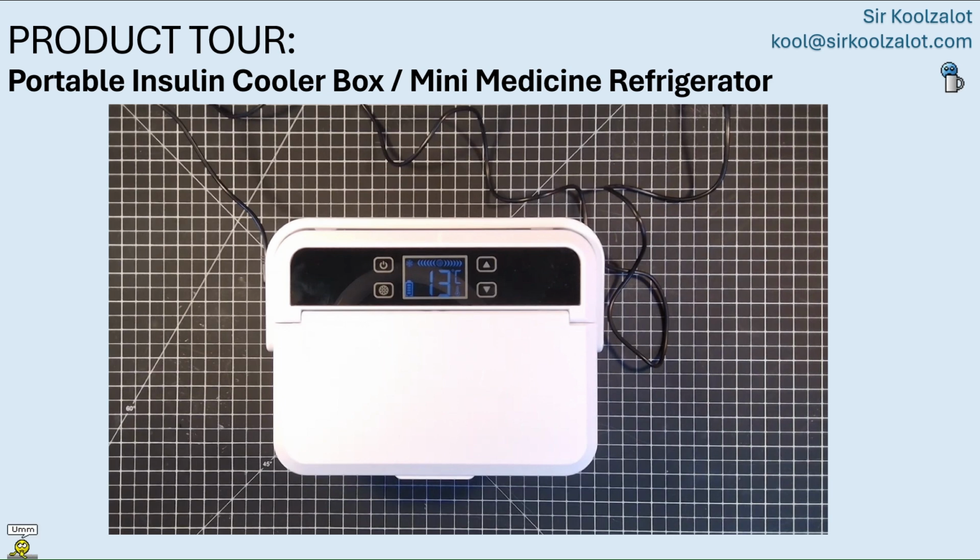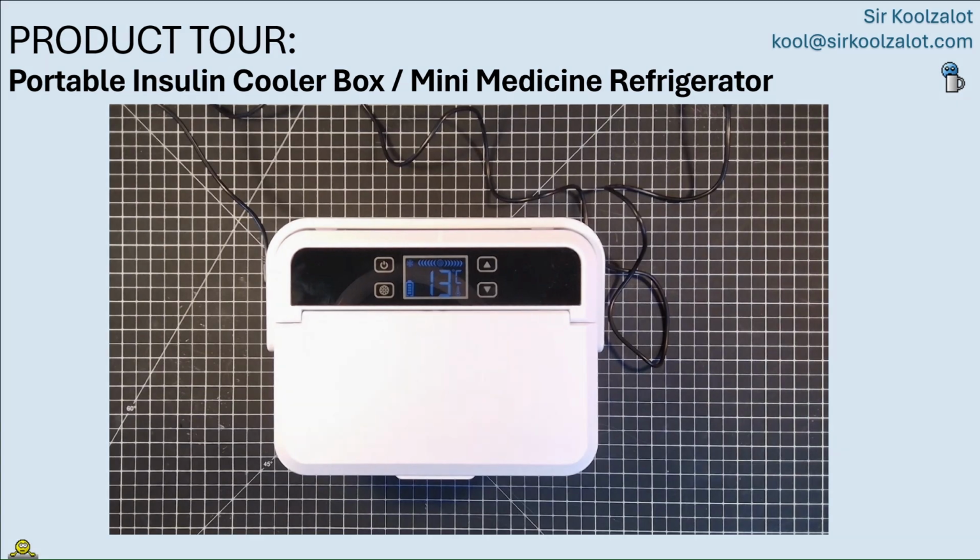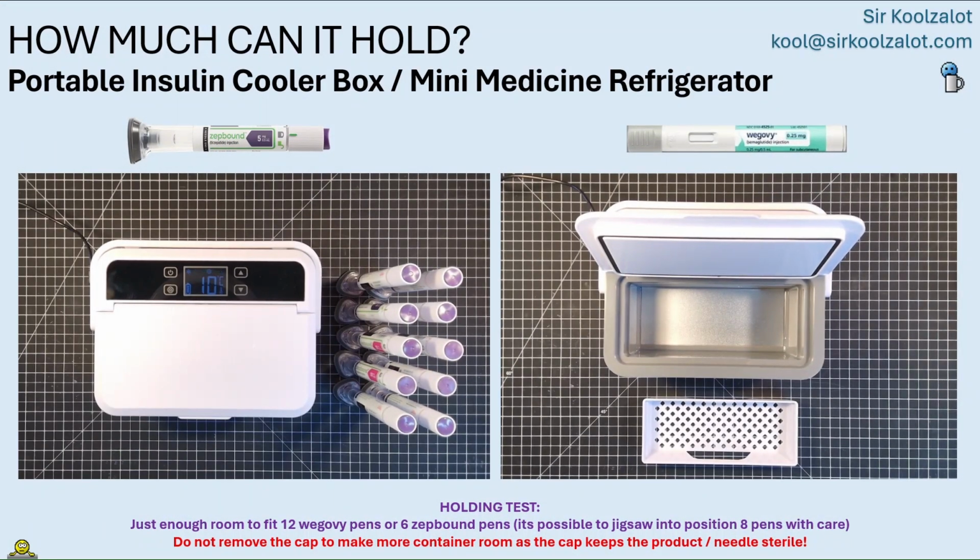The power button, you press and hold it to switch it off, or press it to switch it on. There is a little battery indicator as well, which sits to the side. I didn't test in detail how good that battery indicator was at actually telling you how much charge is left on the internal battery. So just a heads up, I didn't actually test that. Okay, so let's keep going.